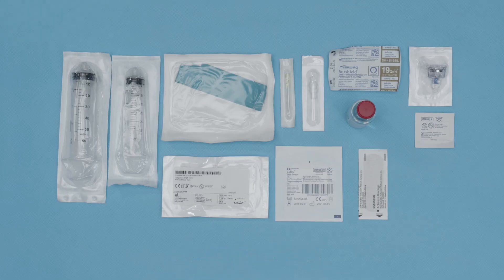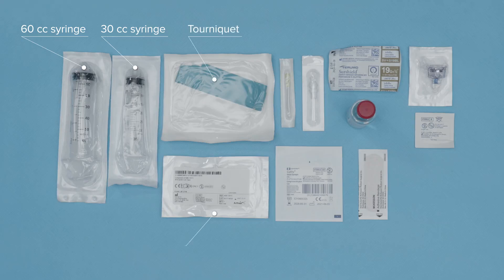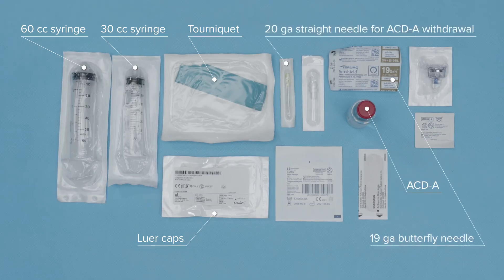The ACP Max device contains an inner and an outer tray. The outer tray has all the components necessary for your peripheral blood draw. You have two syringes to draw up to 90 cc's of peripheral blood, a tourniquet, caps to sterilely cap your product, ACDA to load on syringes for the peripheral blood draw, and what you need to bandage after the draw, including a gauze pad and a band-aid.